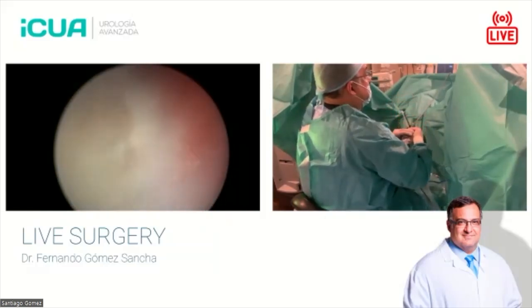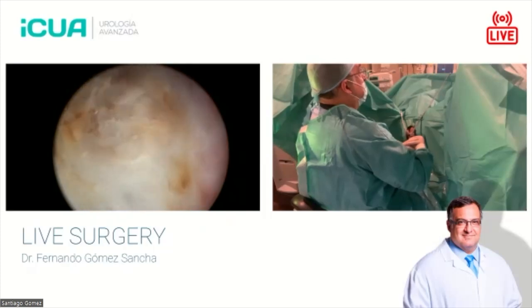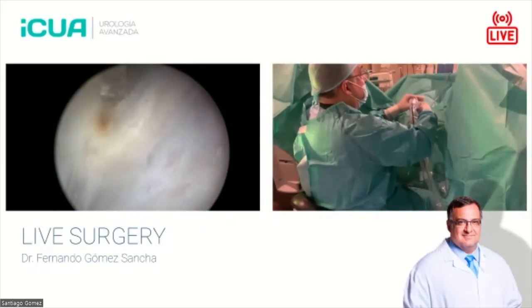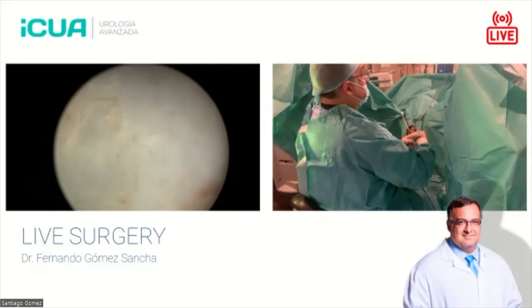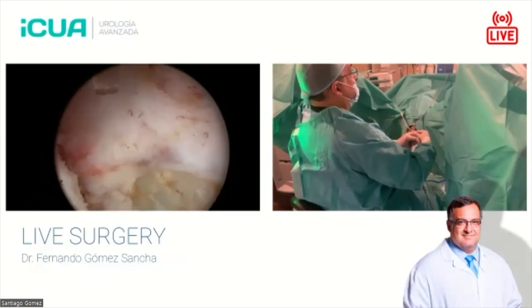See if this dissection, following my line of dissection, will take me towards the bladder neck opening that we just did. So here also, I am very, very careful looking at the characteristics of the tissue. But so far so good, I'm following my line of dissection. You see, I do wide dissection movements. I don't deepen just in one area.